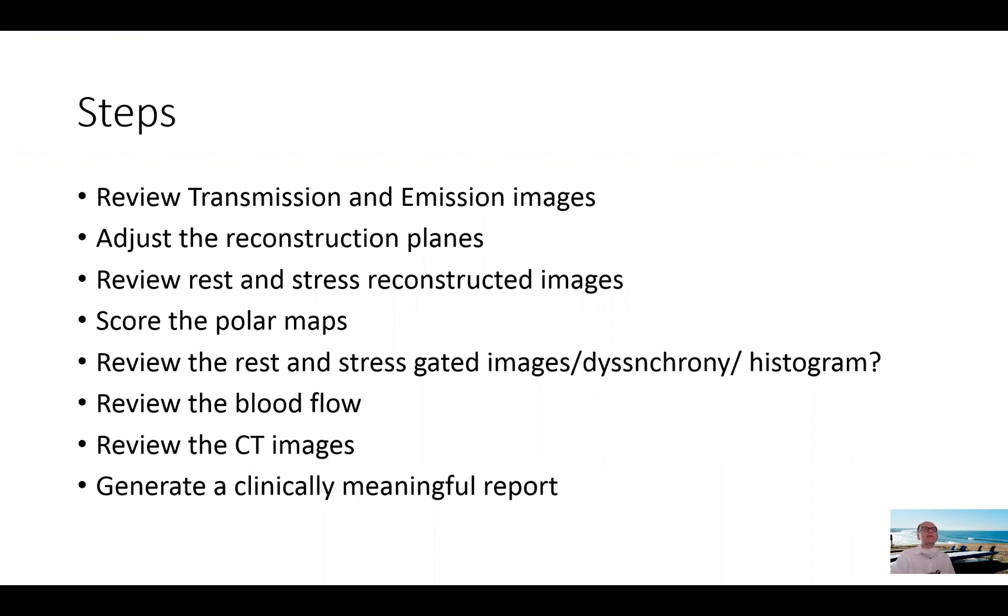So the first step is to review the transmission imaging and the emission images, adjust the reconstruction planes, review rest and stress reconstructed images, score the polar maps, review the rest and stress gated images with all what comes with them, review the blood flow, review the CT images, and finally, more importantly, generate a meaningful report.